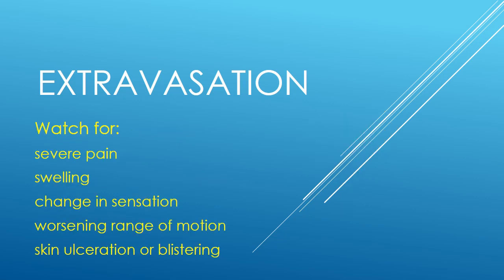So what do you do? Most often, the extravasation will subside by itself and will not produce any sort of adverse event. But you keep watching for severe pain, swelling, change in sensation, worsening range of motion, and skin ulceration or blistering. Now, if these things happen after extravasation of IV contrast, then you had better refer the patient to a surgical department to manage it.